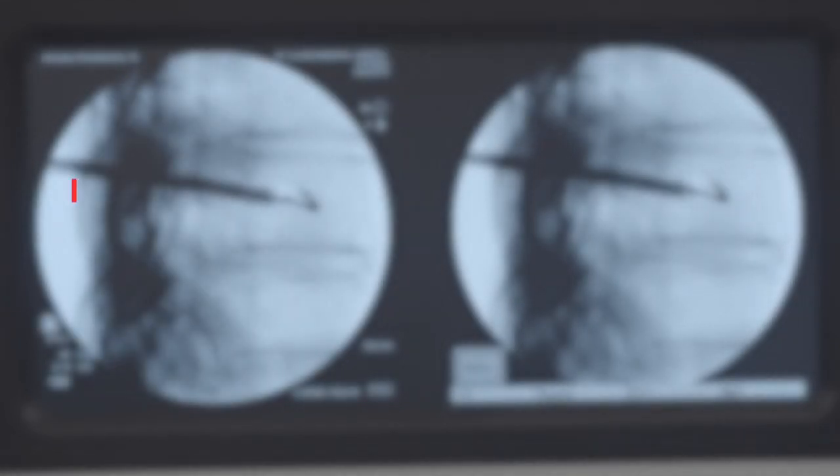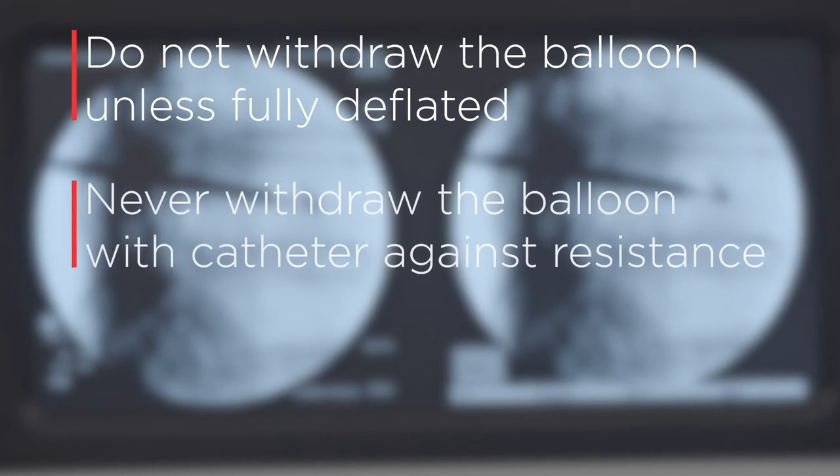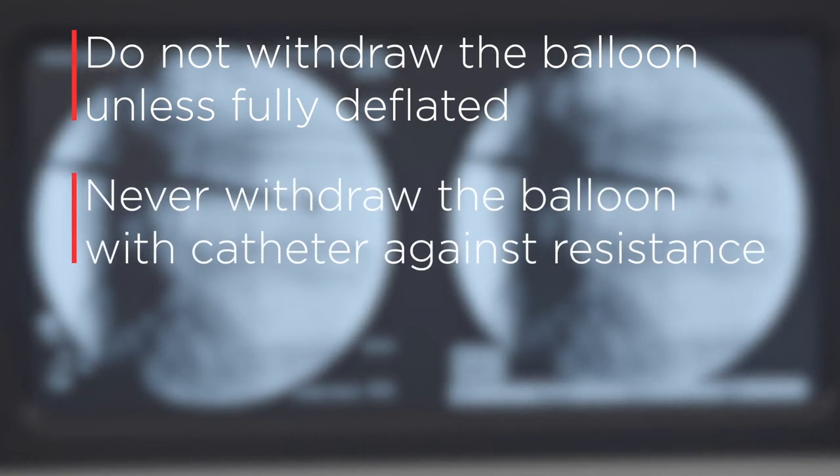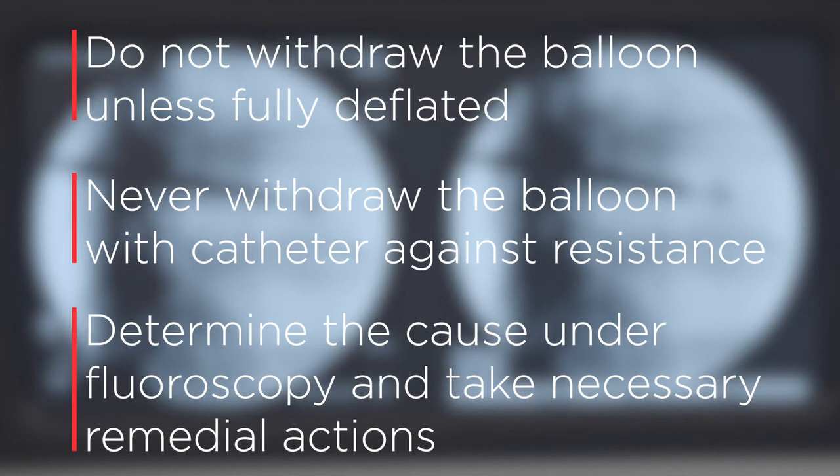Do not withdraw the balloon catheter unless it is fully deflated. Never withdraw the balloon catheter against resistance. Determine the cause of resistance under fluoroscopy and take the necessary remedial actions.